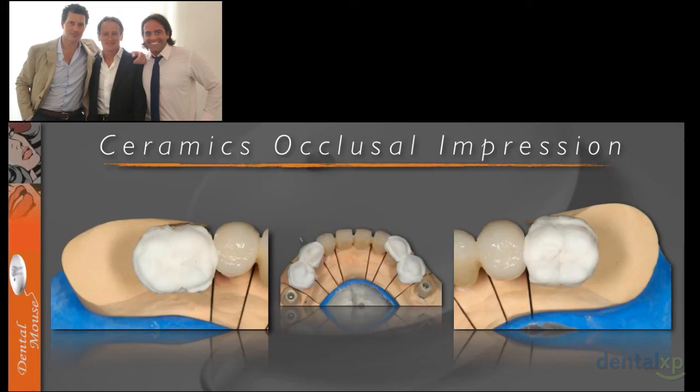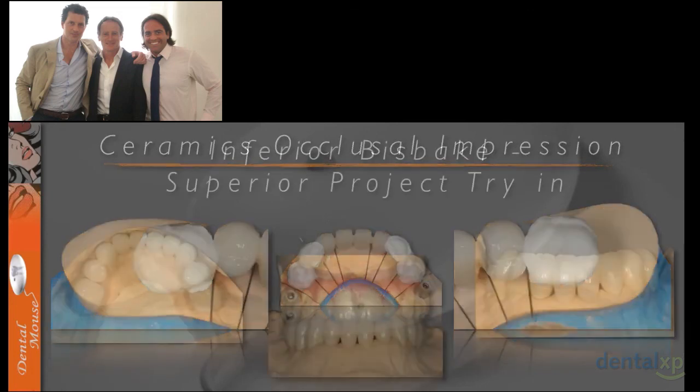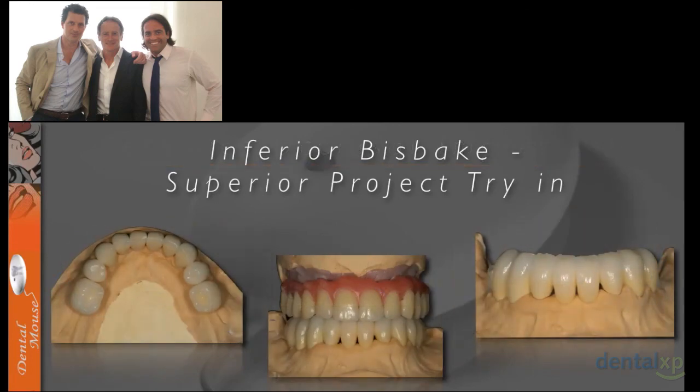So he starts putting his knowledge, his final work, let's call it like this, into our restoration, and he works on the occlusal point of view. After that we give him an occlusal registration, because remember, the occlusion is also important. We are rehabilitating a case that was Angle class III, and we are going to bring it to class I. So the occlusal part has to be studied really carefully in order not to have a failure, and not to have chipping later on in the follow-ups.